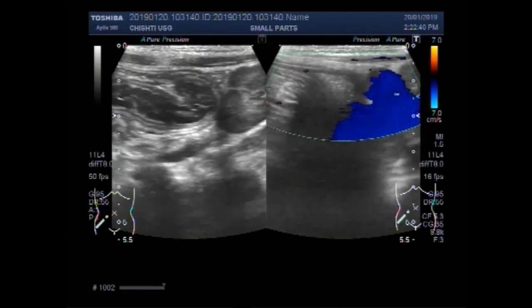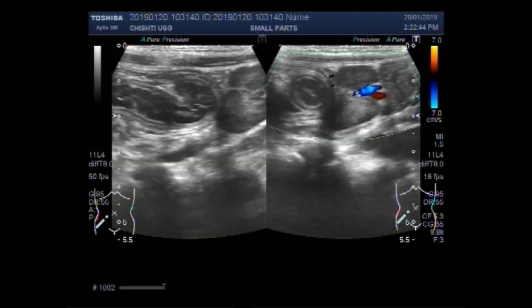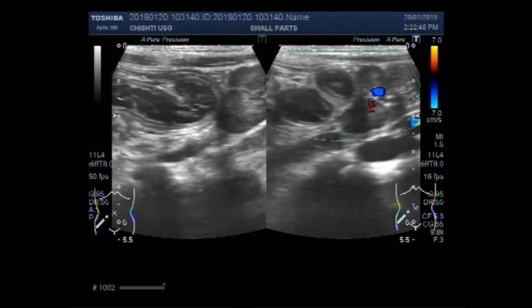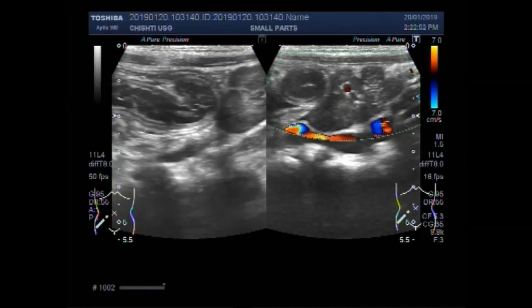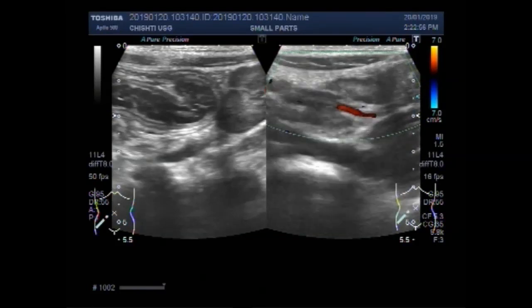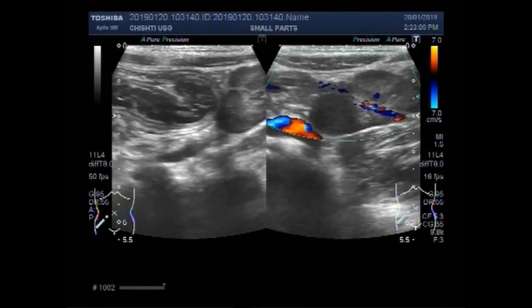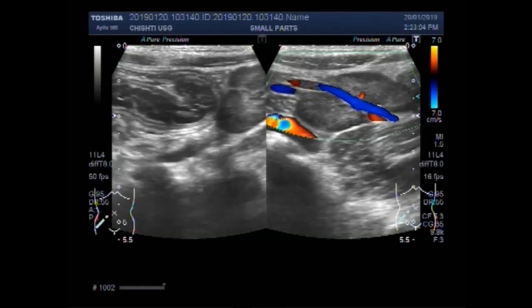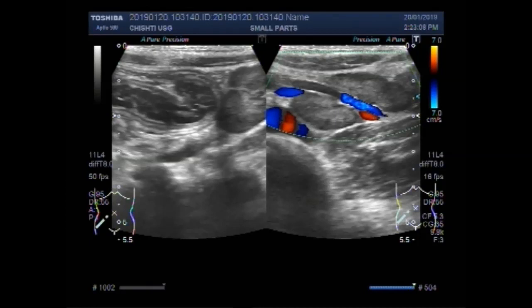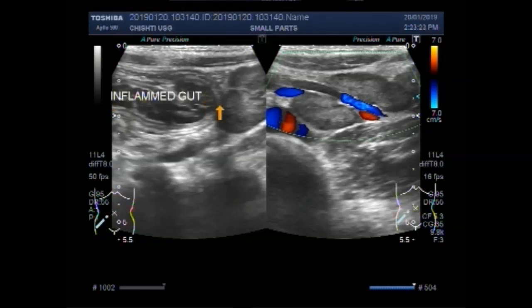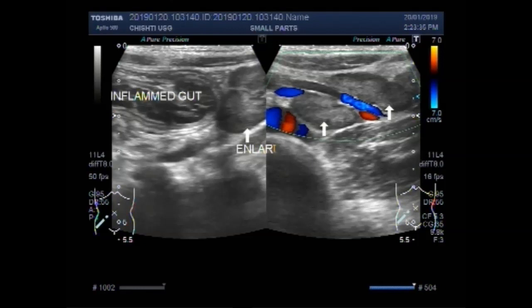You can see the mesenteric vessels. You can see the enlarged lymph nodes. These are the enlarged lymph nodes seen along, just beside the inflamed gut. These are the enlarged lymph nodes.